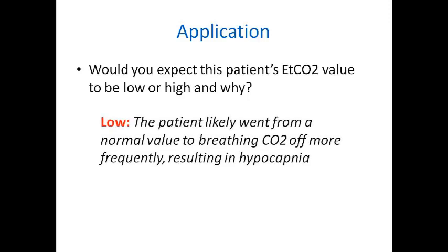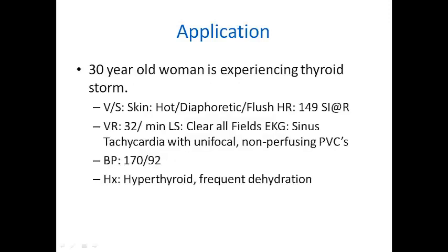We would expect the value to be low. The patient was likely normal capnic, and when they started to increase their ventilatory rate, they blew off CO2 faster than they needed to.